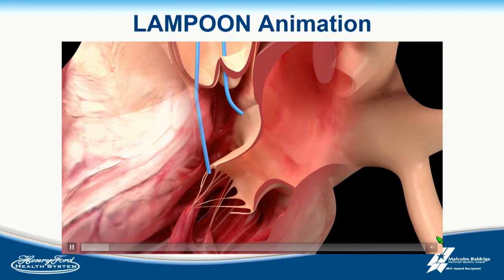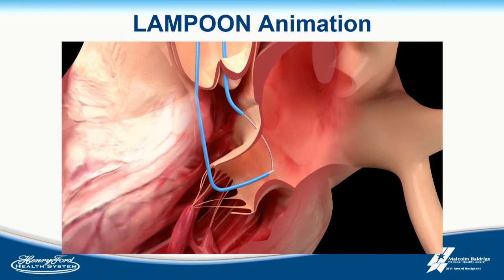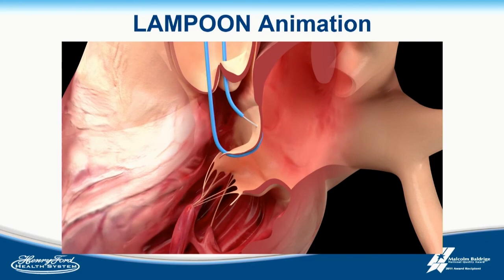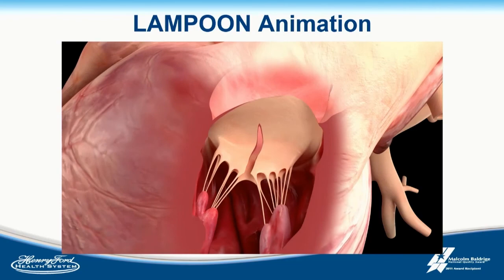It's retrograde, two 6 French JL4 catheters, one at the base of the A2 leaflet with what we call standard transcaval technique. You can burn through the base of the leaflet and then grab the wire and create a lasso. And then with, again, transcatheter electrosurgical principles, you can now electrify the side of this wire and pull and lacerate the leaflet. Interestingly, very well tolerated, because this picture, although an animation, I think is accurate, that it doesn't spread that much until you put the valve in.